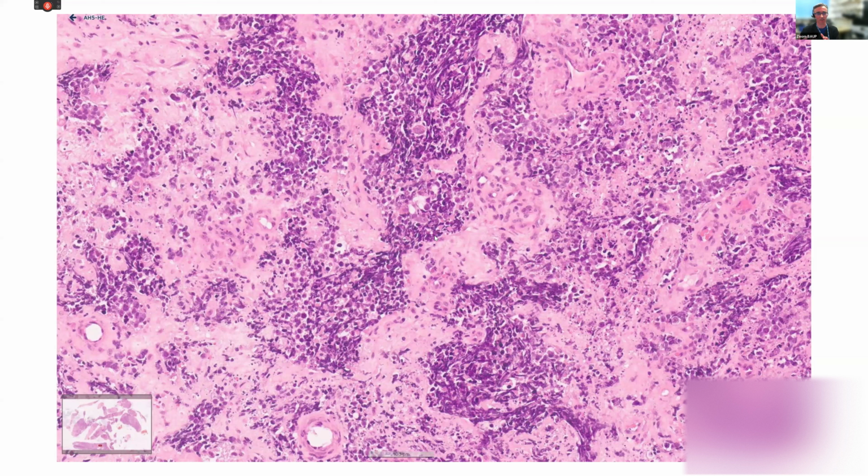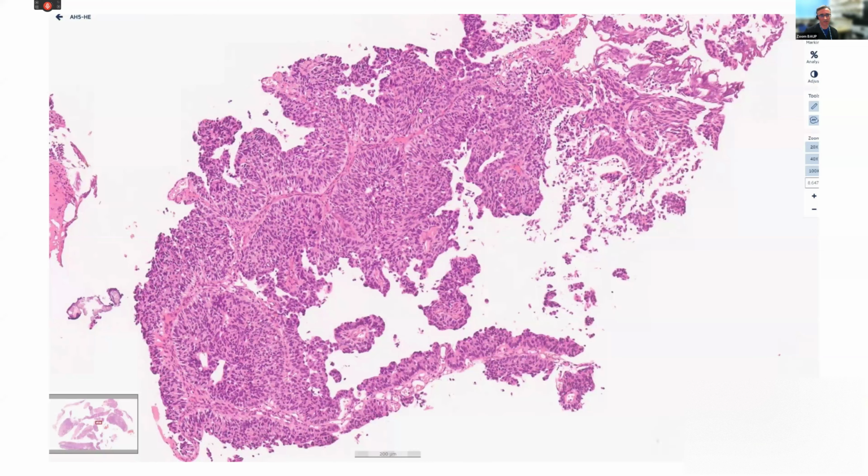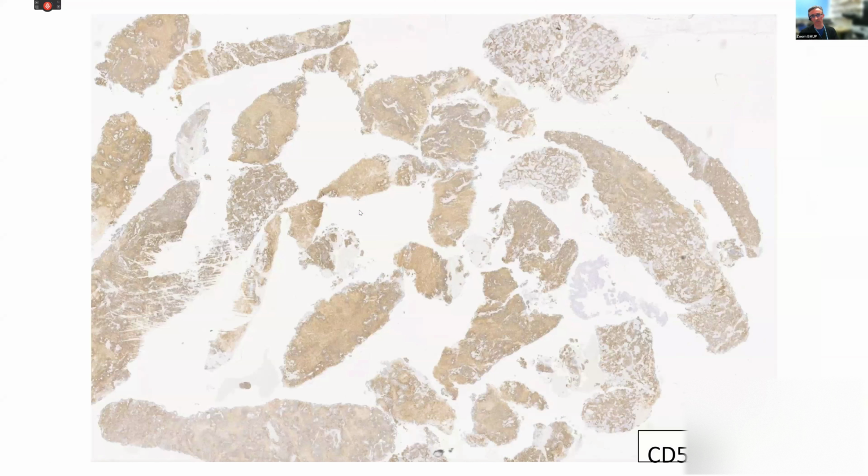So it did look like a neuroendocrine carcinoma, neuroendocrine small cell carcinoma. So lots of apoptotic bodies and areas of necrosis elsewhere. So that was probably more than 95% of the tumor, I would say, probably more than that. But then tucked away in that central area was something that did look different. So a papillary proliferation, nice fibrovascular core, looked high grade, but very small in number and looked completely different to the neuroendocrine carcinoma. So the immunohistochemistry seemed to support this.